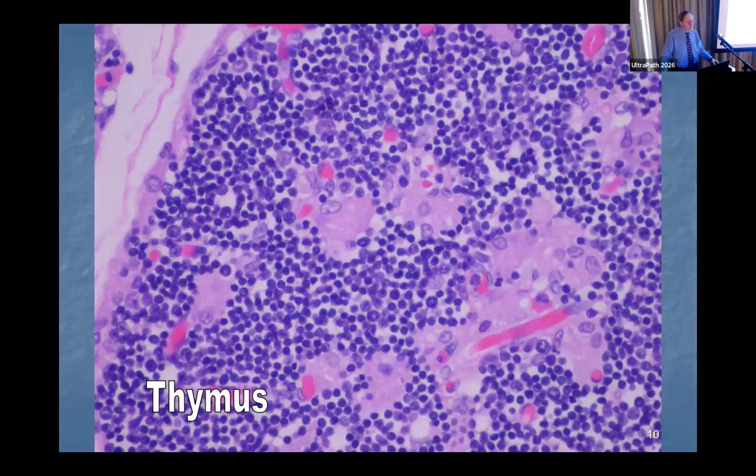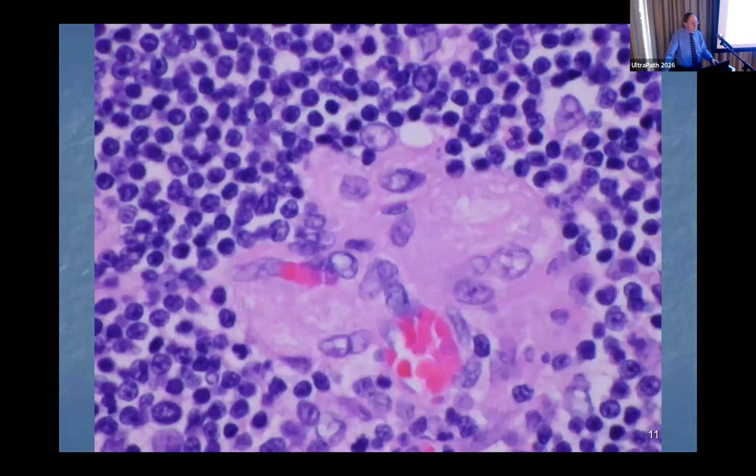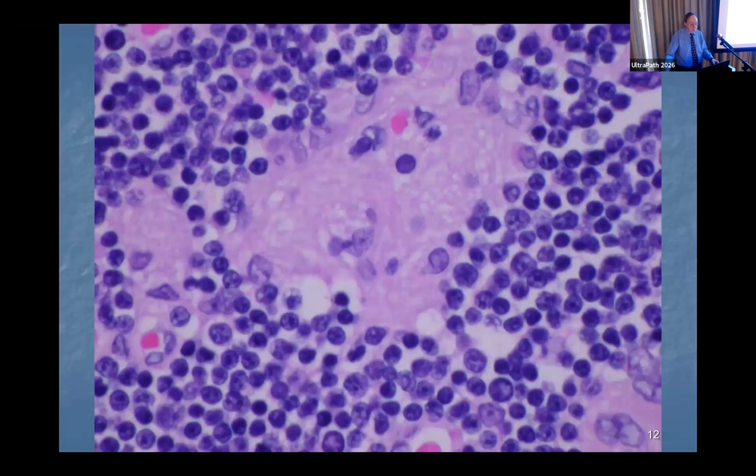This is tissue from the thymus, and right away you can see the background of typical sort of lymphocytes in the background. Then you see these very enlarged cells that have very sort of fibrillary look to them, vascularizations associated with these areas, and something that typically you don't see. These are not Hassall corpuscles in the least bit, and you see this as well.